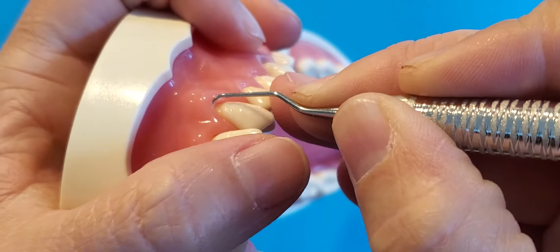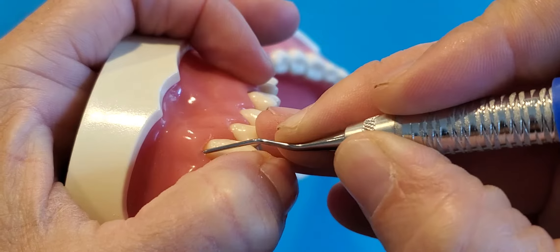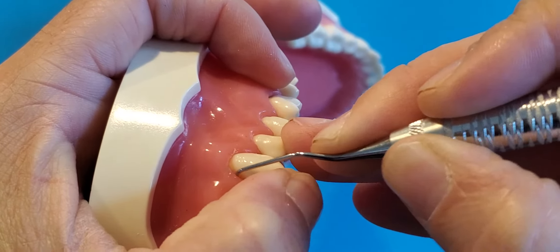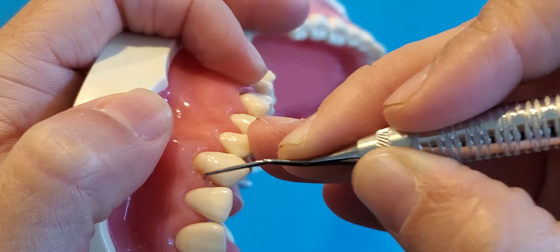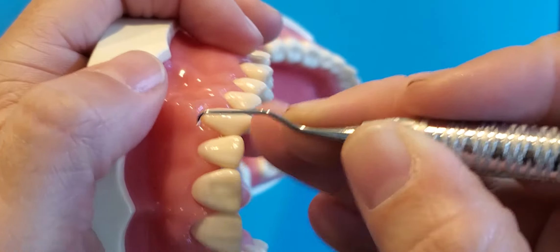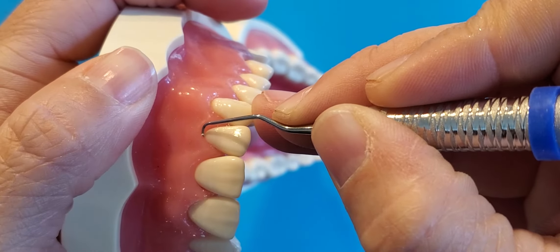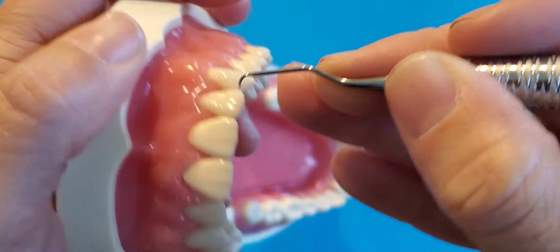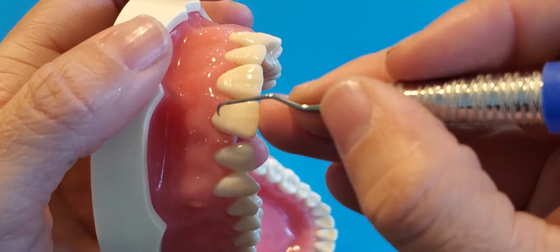So you might start on the toward surfaces at number 11, doing all of the toward surfaces. Start, keep your fulcrum one tooth away, midline, into the mesial, on all of the anterior toward surfaces.